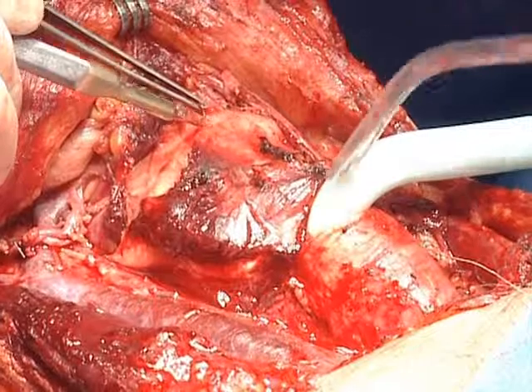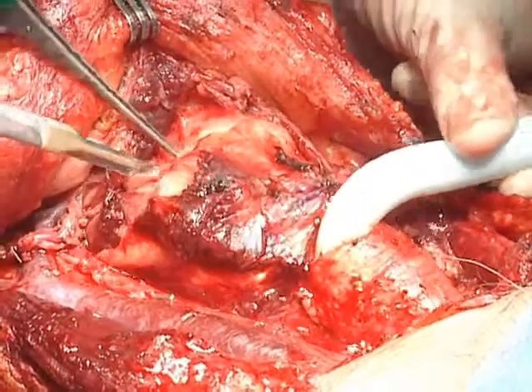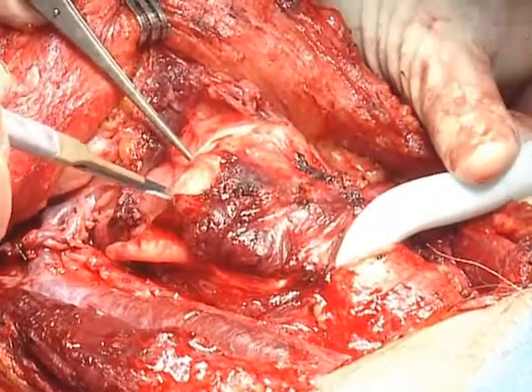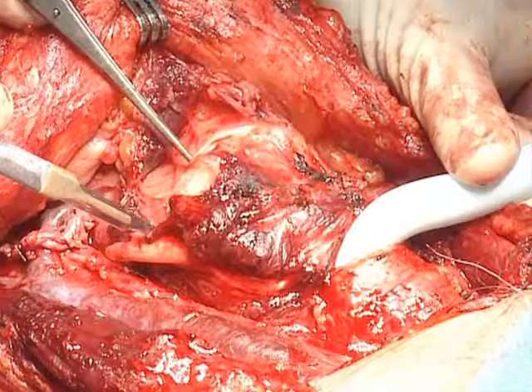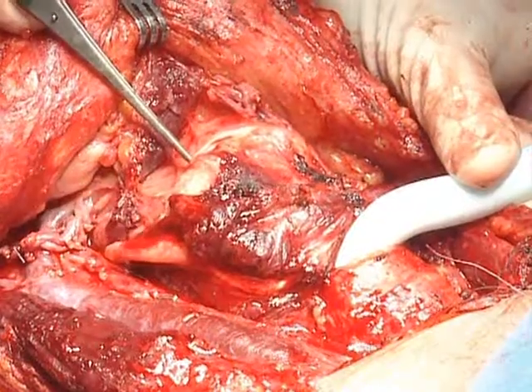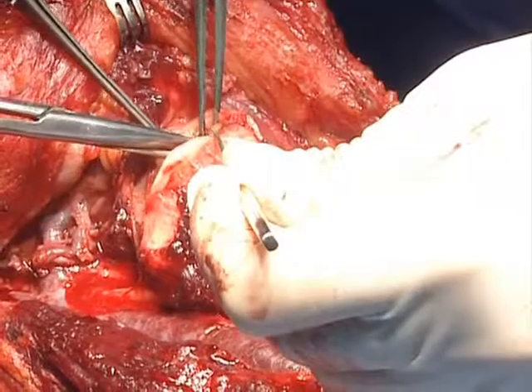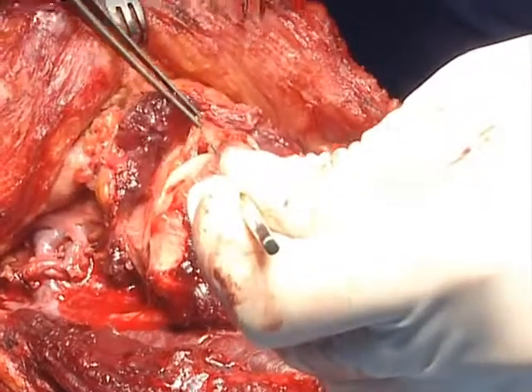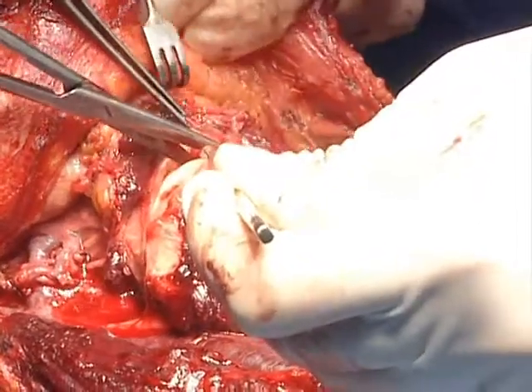At the upper side, the thyroepiglottic ligament is incised. The epiglottic petiole is sectioned and the larynx is opened superiorly.